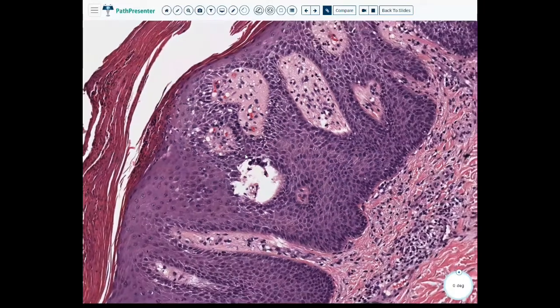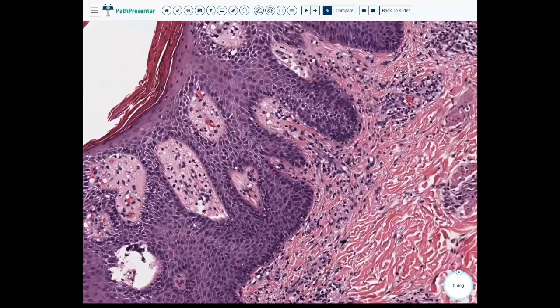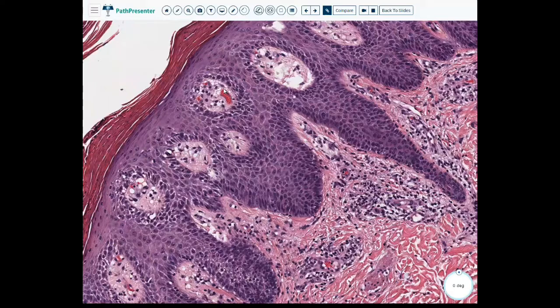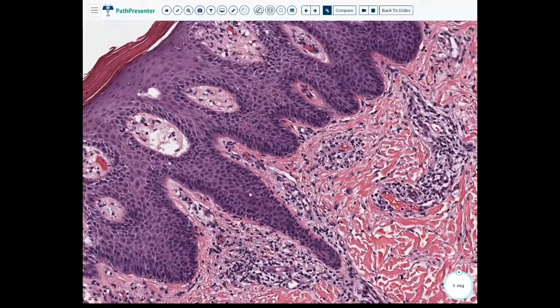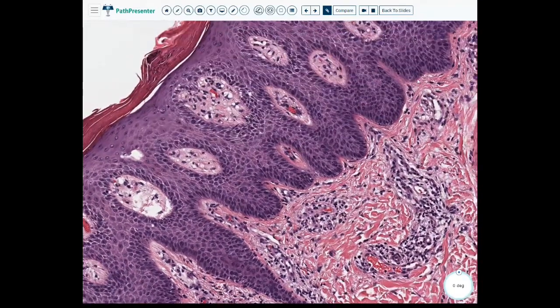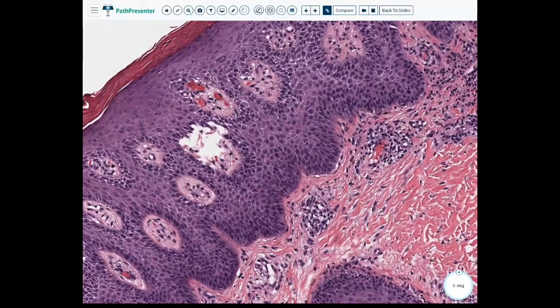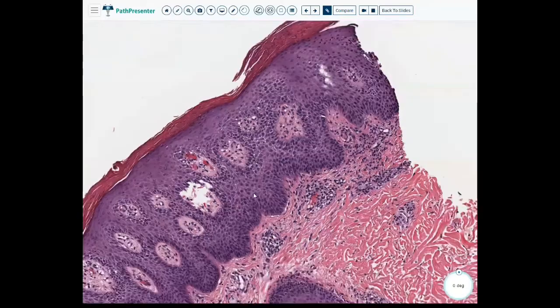We also have maybe not the best dilated vessels in the dermis. Like here's one. So this is definitely dilated. You can see that it's filled with red cells. And other features that we are looking for would be like red cell extravasation. So let's see if there's some better dilatation. Okay, so there's some extravasation, even though that's maybe a little on the weak side. Let's see if this other piece maybe has more.